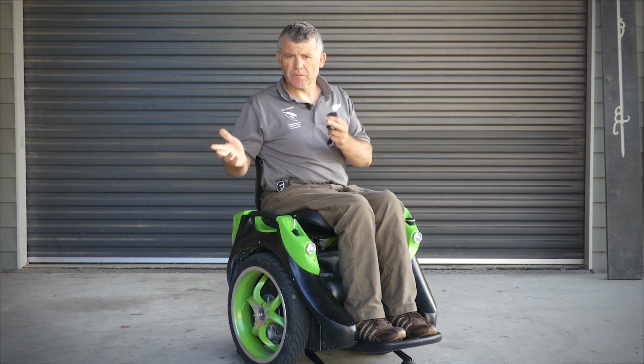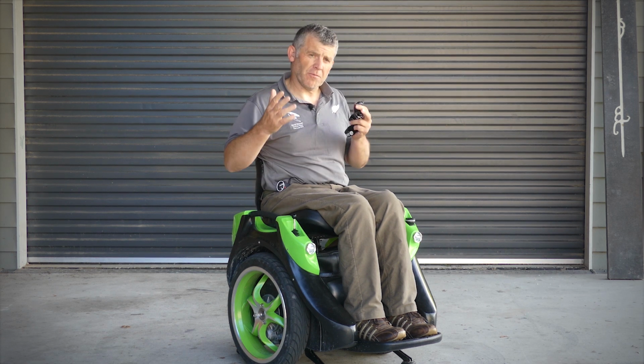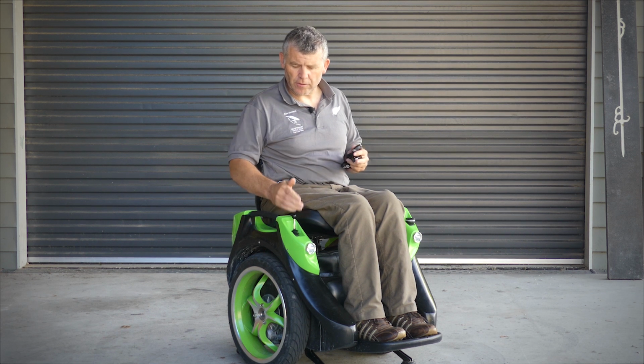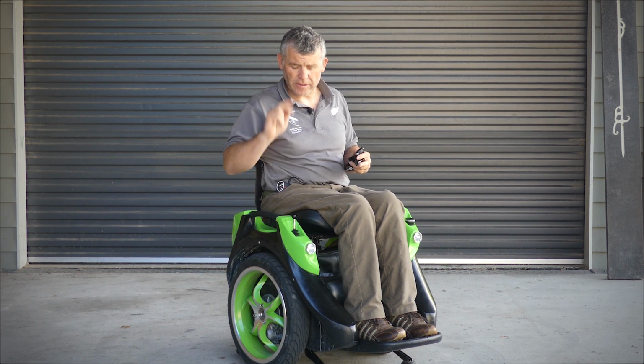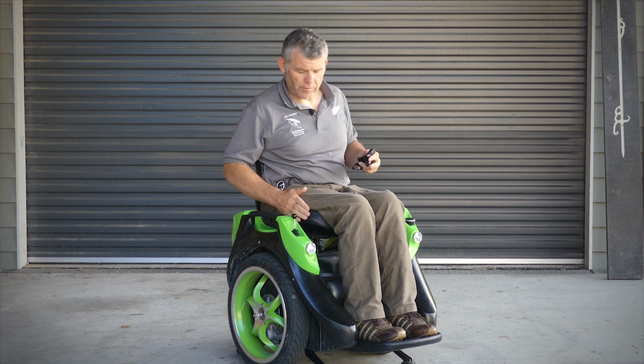Okay, so when I flipped it over, it spun me off on a spin and put the machine into emergency shutdown. It didn't like what was happening between the steering sensors. Two steering sensors, one for the joystick, one for the active seat control that runs through the seat.